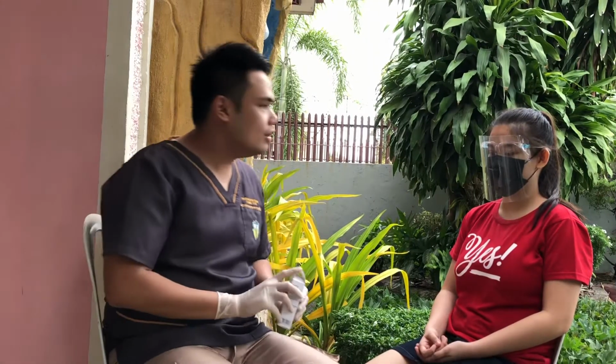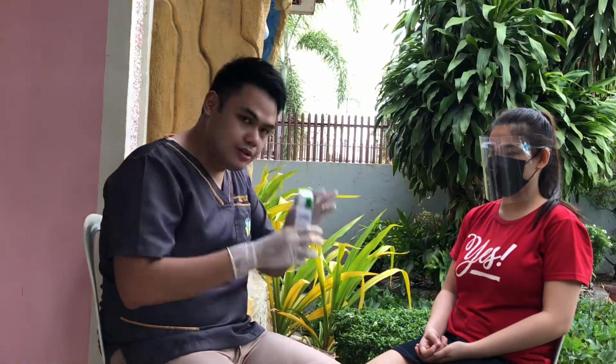Installation of nasal spray. Prior to the administration of the nasal spray, ask the patient to gently blow their nose to clear the nose.